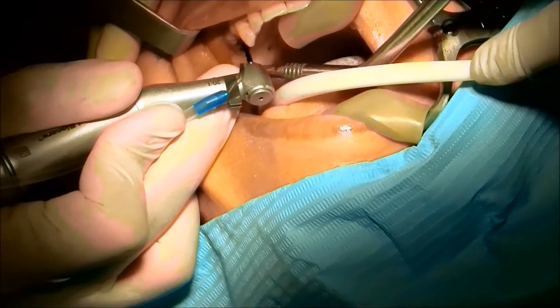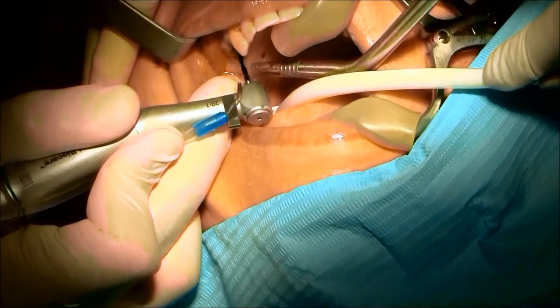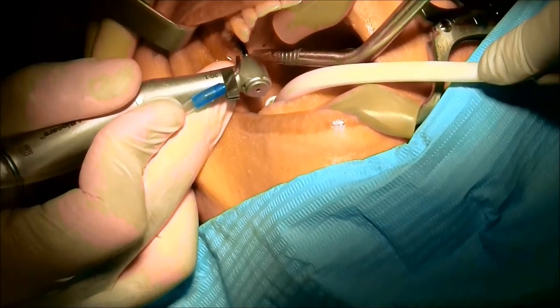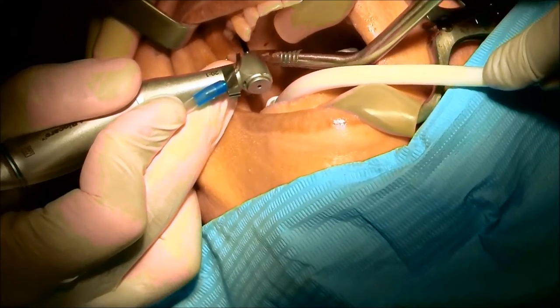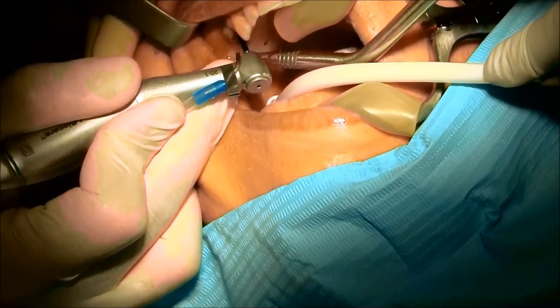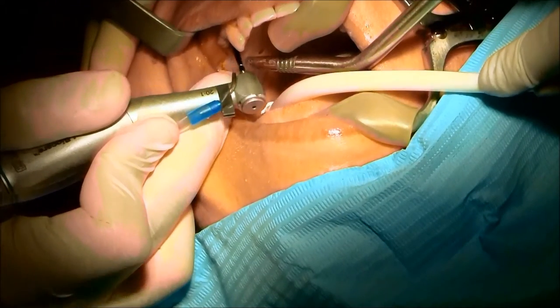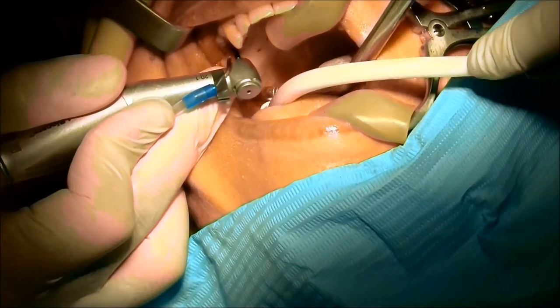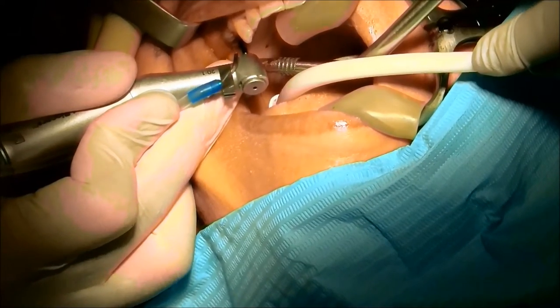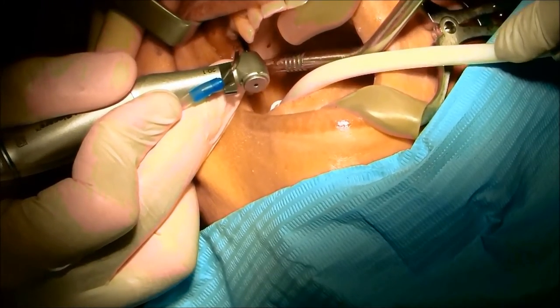We're checking the three-dimensional position of the implant. You can see I'll stop the drilling and pull back once in a while, then go again — measuring and checking again and again.